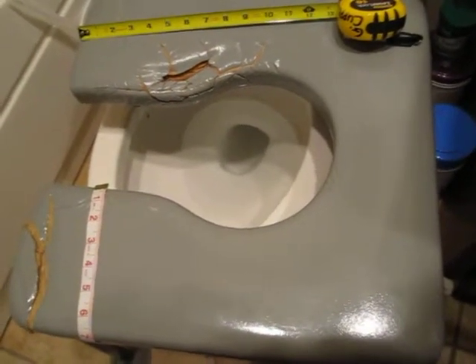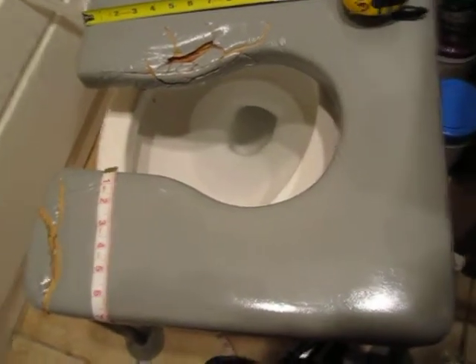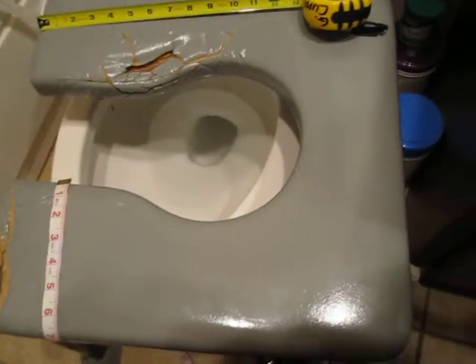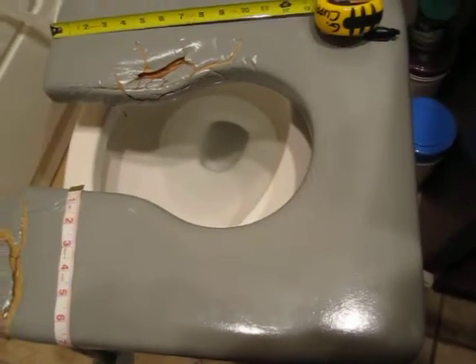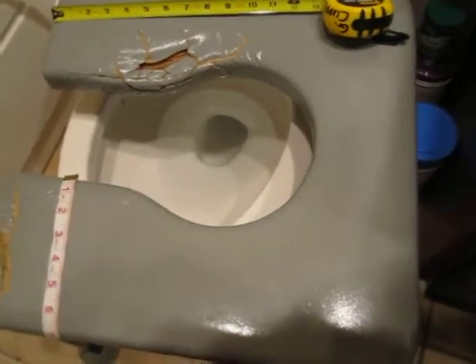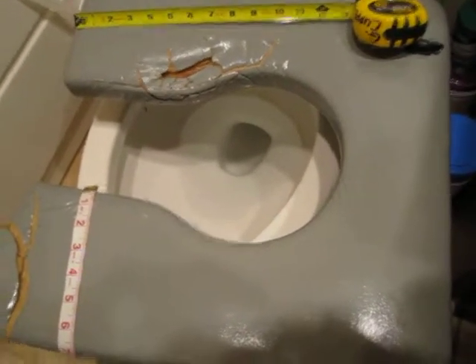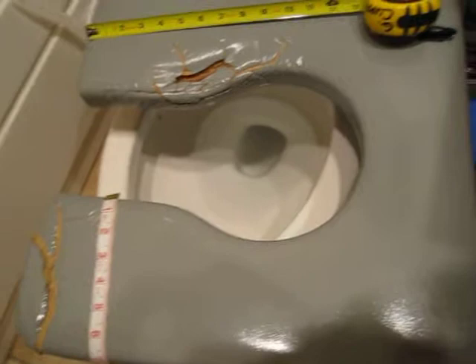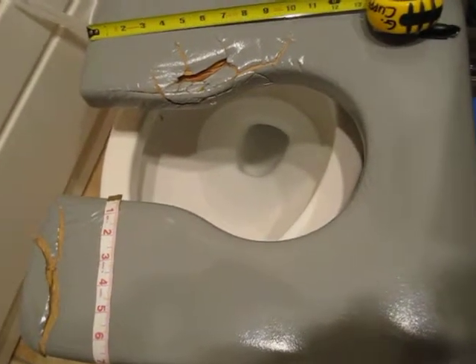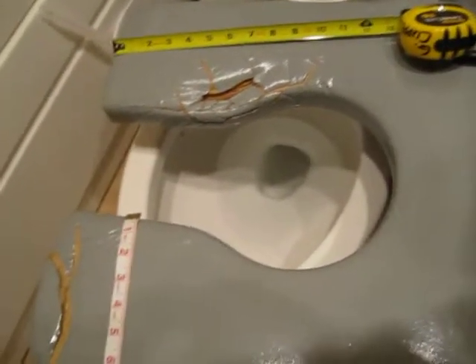This is a video of my raised toilet seat made by ActiveAid Inc., serial number 102030. This video is meant to show the extreme amount of deterioration that has occurred in the period of time that I've owned this piece of equipment, which is a little more than a year.